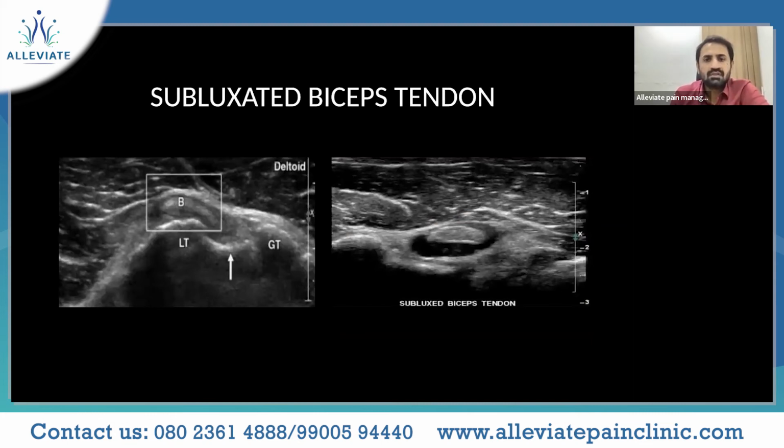This is subluxation of the biceps tendon from the groove with tenosynovitis as well.